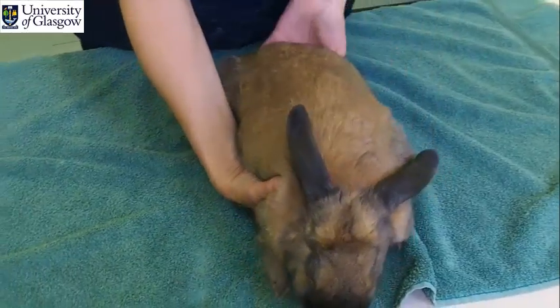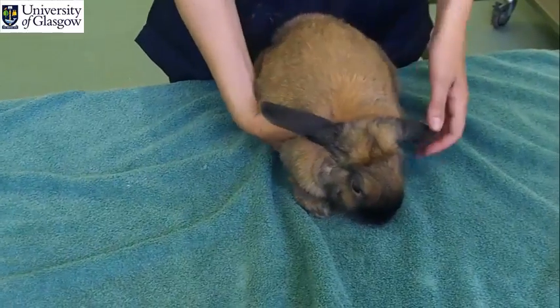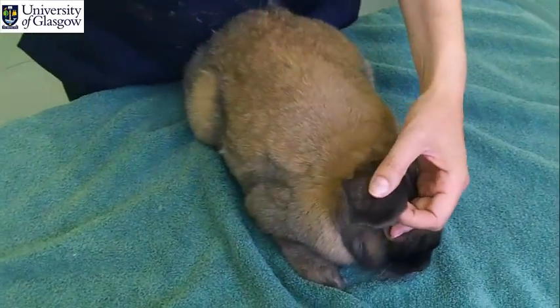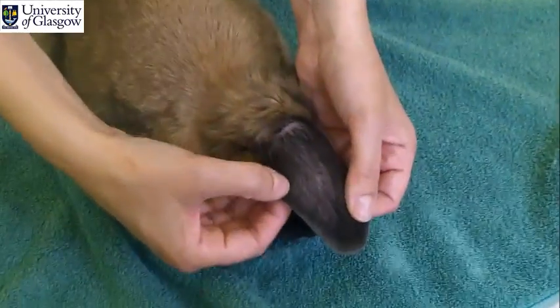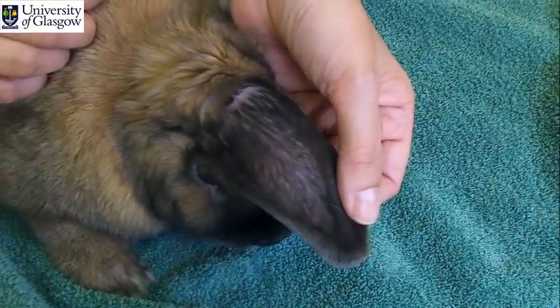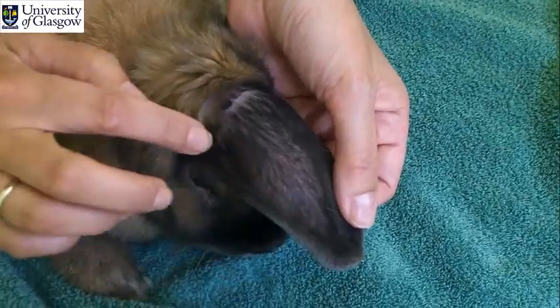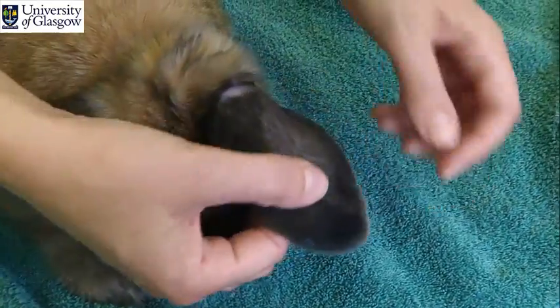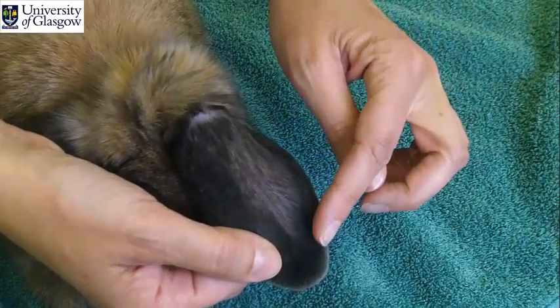For intravenous injections, we can use the marginal ear vein that runs just along the edge of the pinna of the rabbit, in this position, or with the other ear along this edge.